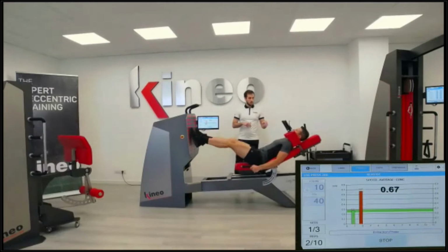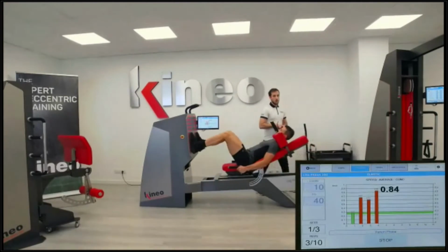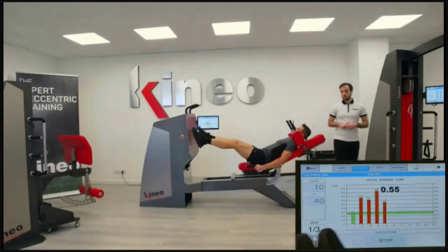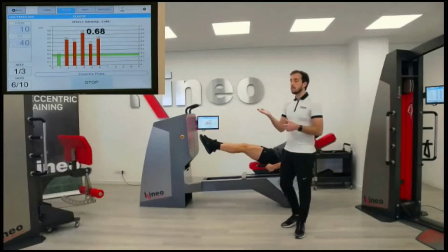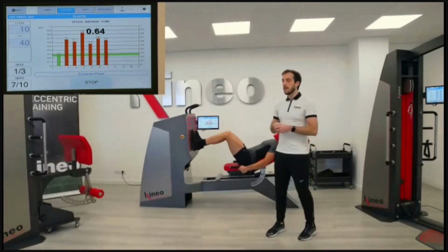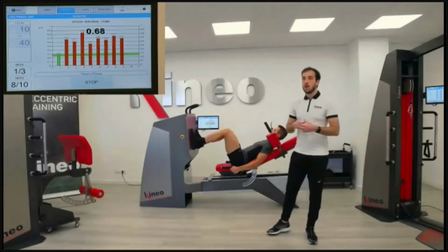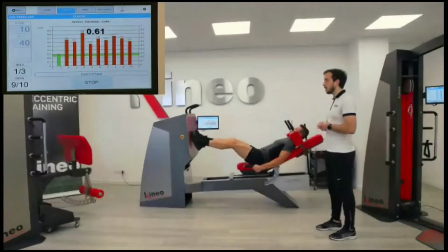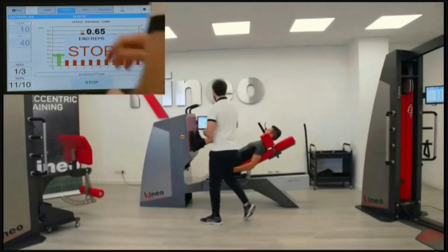Good. Okay, so if we ask Damiano to do more plyometrics, we build up more eccentric loading, and then he can use that stored force to do powerful jumps in the concentric. Thank you, Damiano. Okay. All right.